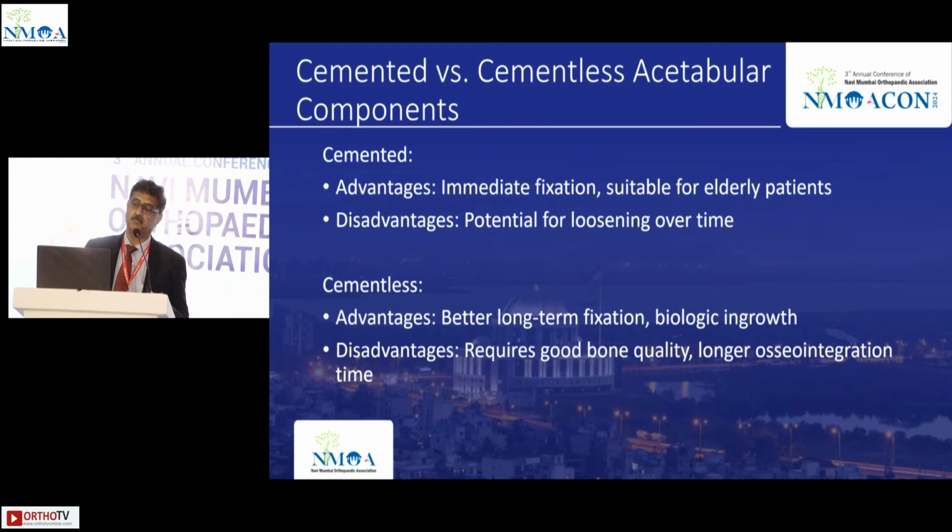If we talk about cemented versus cementless acetabular components, what are the advantages of cemented? Immediate fixation, and it is suitable for elderly patients where bone quality is weak, so we can consider cemented in that. Disadvantages are potential loosening over time. We have seen a lot of patients where over a period of time the cement cup gives up.